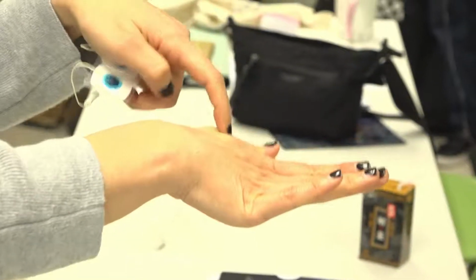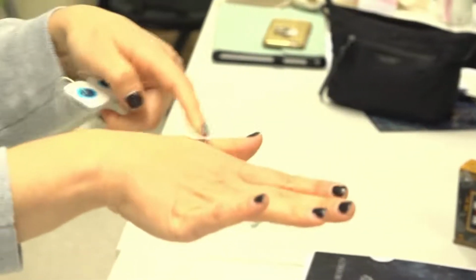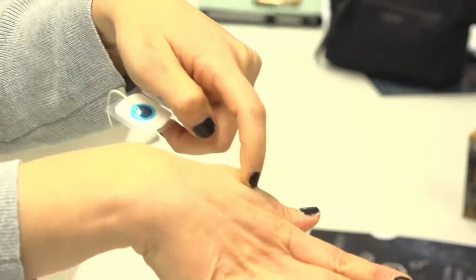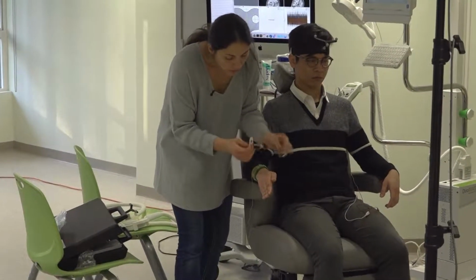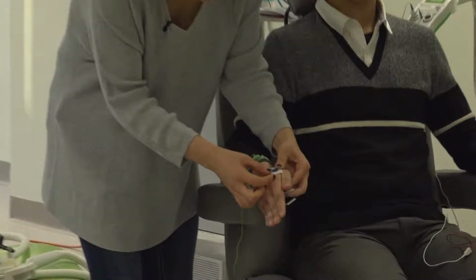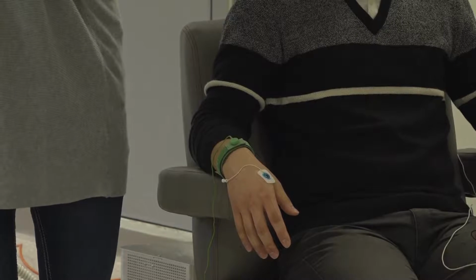I do it like this and put it in the higher part, yeah? The idea is that sometimes when you put the electrode, you put it outside, so you cannot measure. It should be in the middle. It should be in the belly of this muscle. So, show me. So it'll be here. And the other, I will put it here, on the bone.